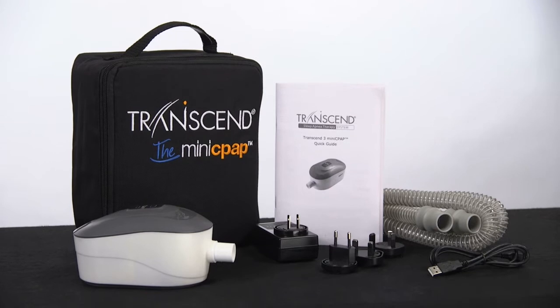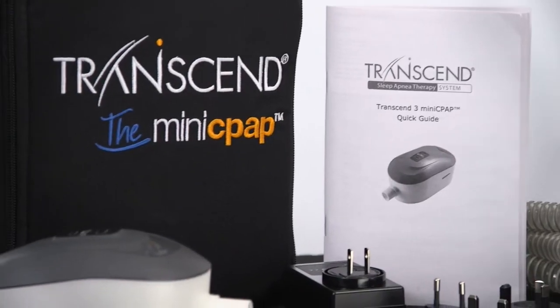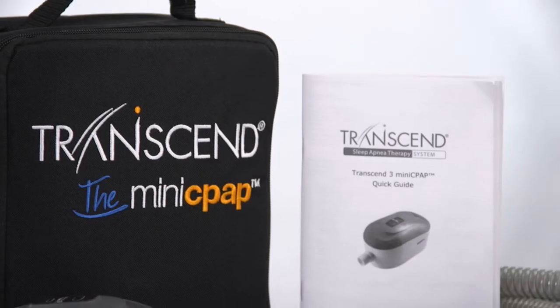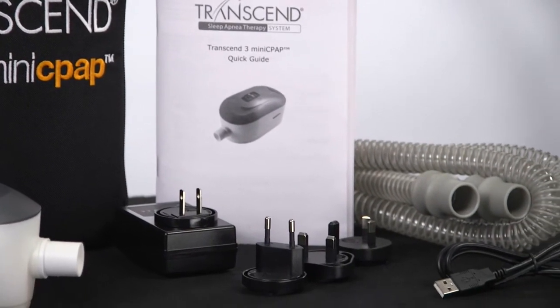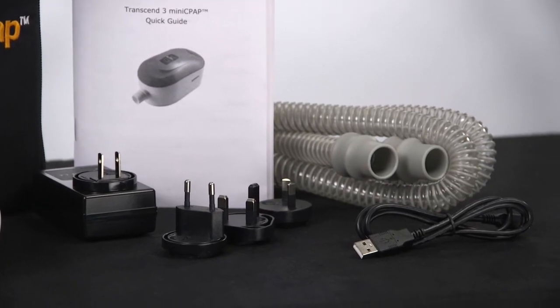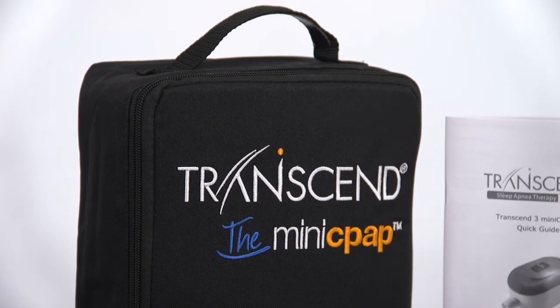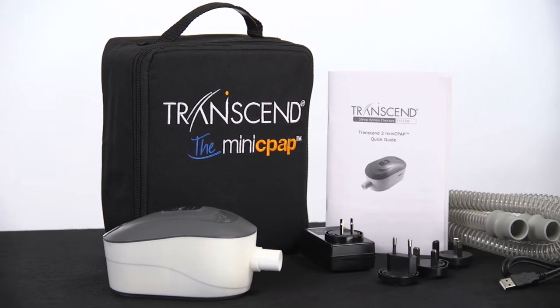I've unpacked this already so you can see the contents. The Transcend 3 Mini CPAP package includes a 6-foot hose, AC power supply, a mini USB cord for computer connectivity, and a printed Quick Guide. It also includes a padded travel bag with a zipper closure and a set of international plugs, so your Mini CPAP is ready to use out of the bag.